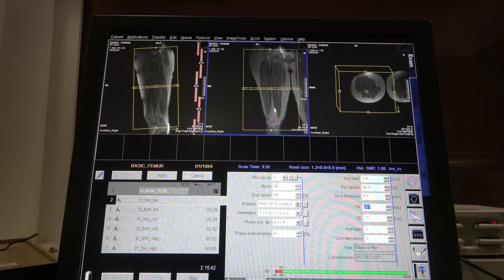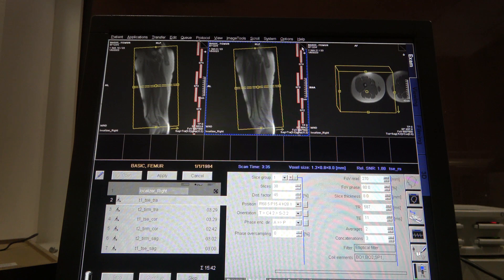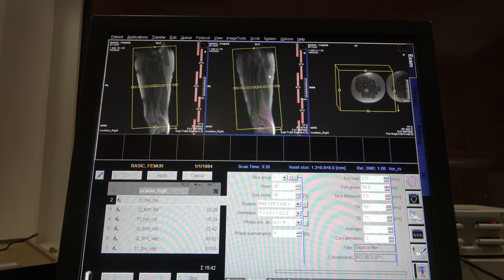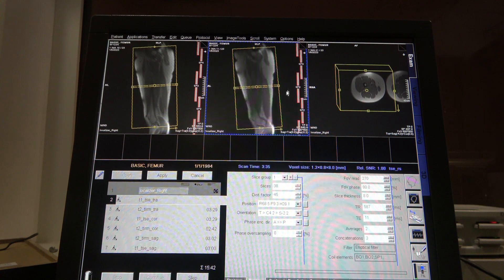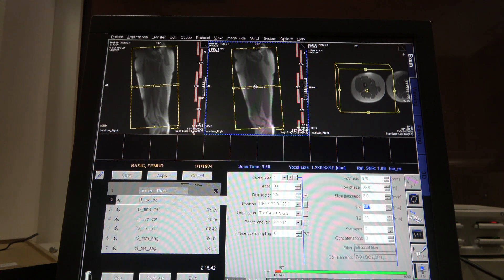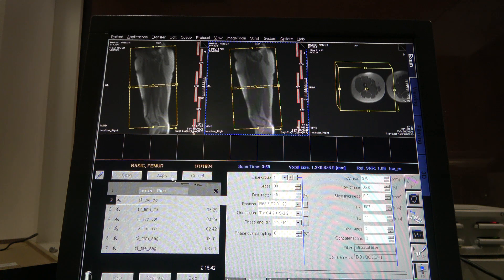I'm going to take out two slices here. Our phase direction is anterior-posterior — you can see here the arrow. Here's the back, so you want to move this closer. Let's make this bigger, just so we can have more space and no overlapping. You saw how that got bigger by just moving the FOV. So there's joint one, joint two — we got everything. Let's run it.